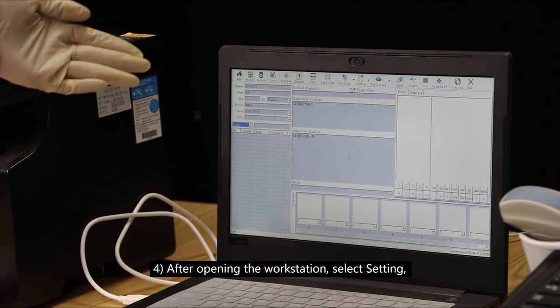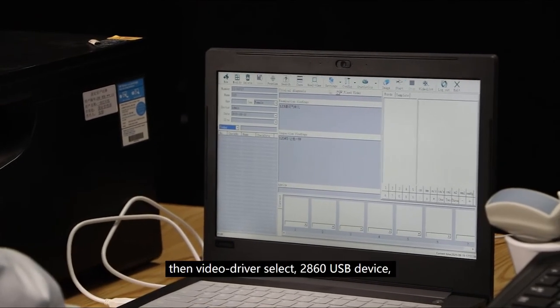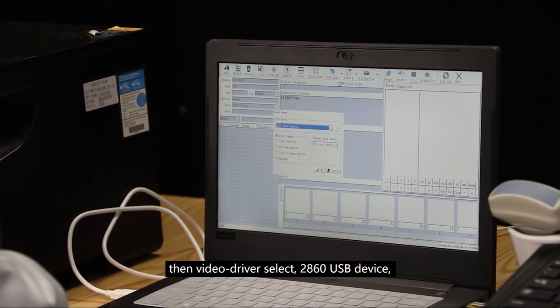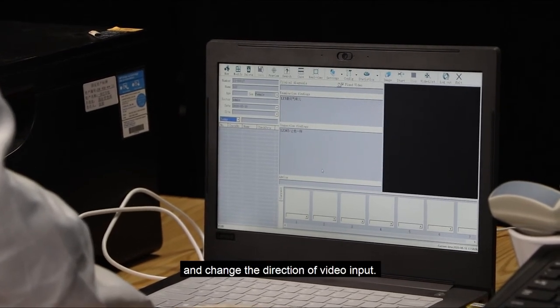After opening the workstation, select Settings. Then select video driver, choose the USB device, and change the direction of video input.